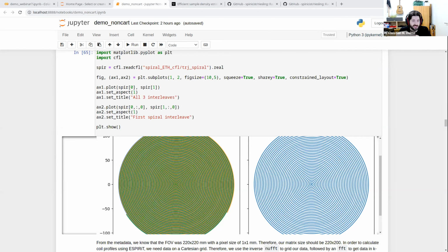So you might just get a tiny bit of blurring from your undersampling. I wouldn't expect anything else. I mean, 50% undersampling in 3D is not a lot. I would expect that if you go to higher undersampling factors, you are going to see more of an issue. Okay, I'll try that. In that situation, maybe PICS might be helpful. Yeah, sure. Okay.